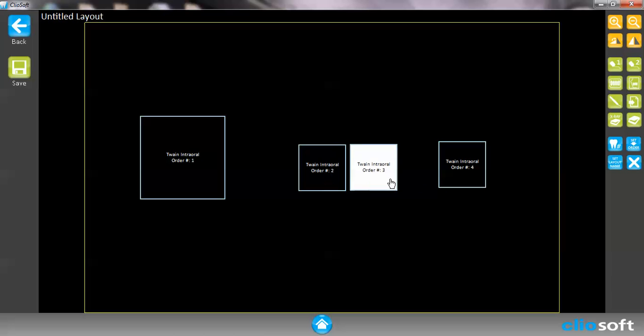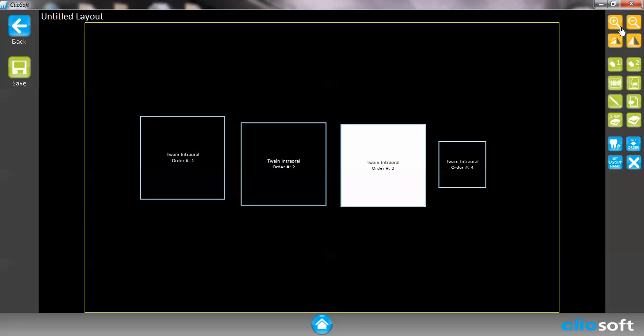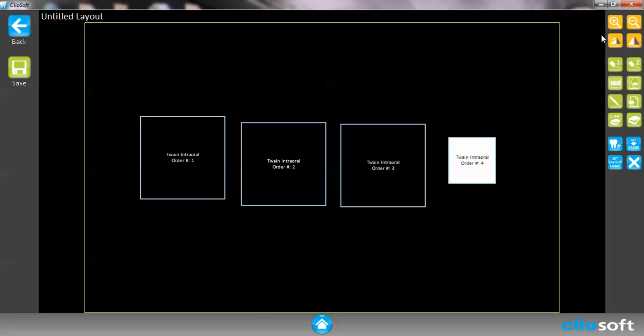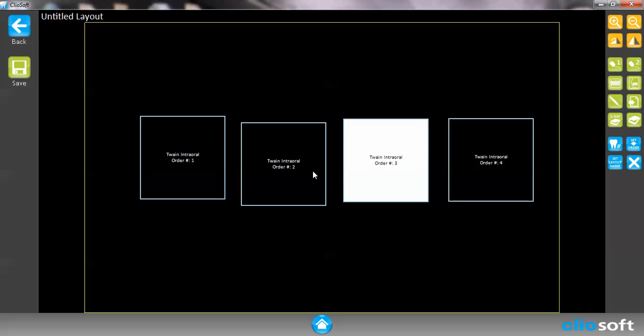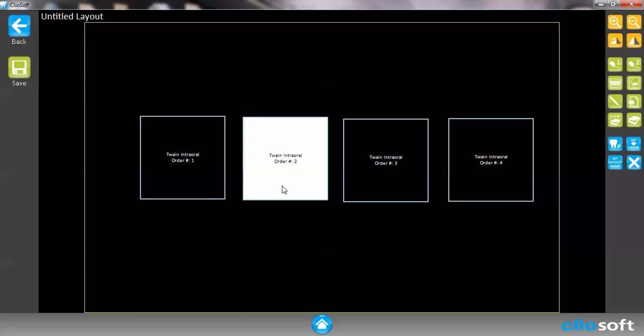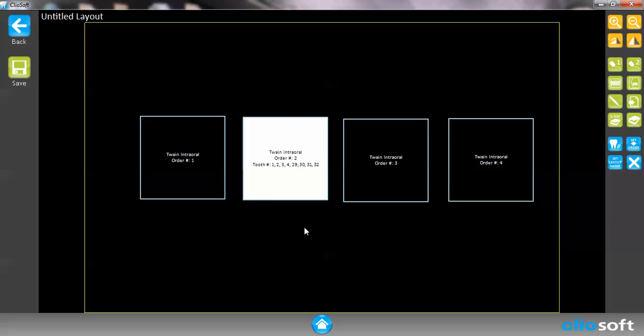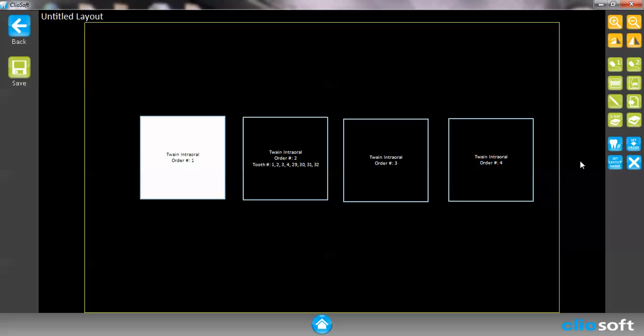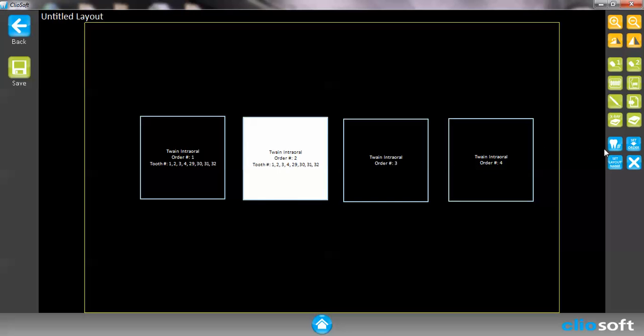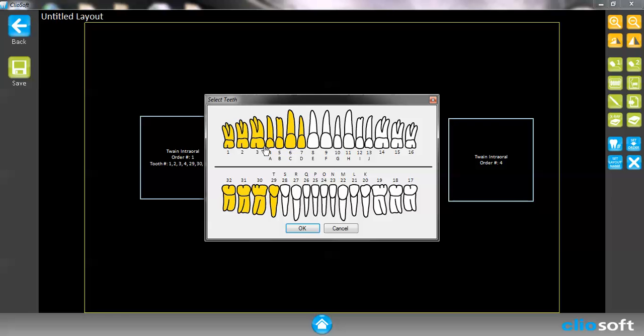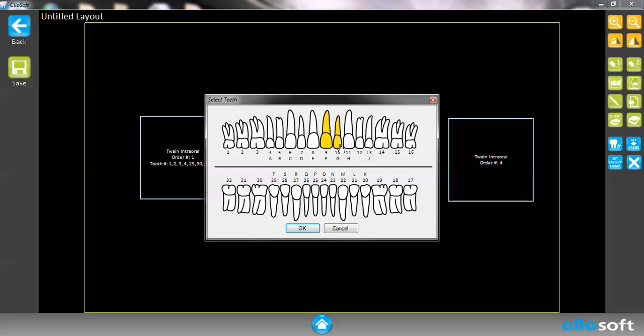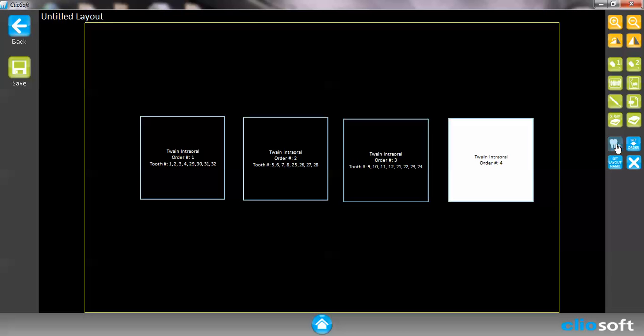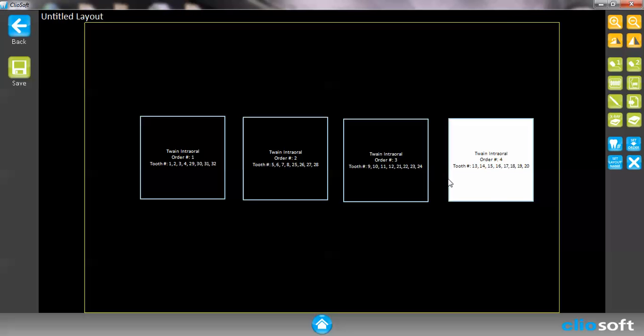Okay, so we got four images. Once I have these placeholders set, I can set the teeth number. For example, this is going to be... [setting tooth numbers]. So now I have my tooth order on my bite wing.